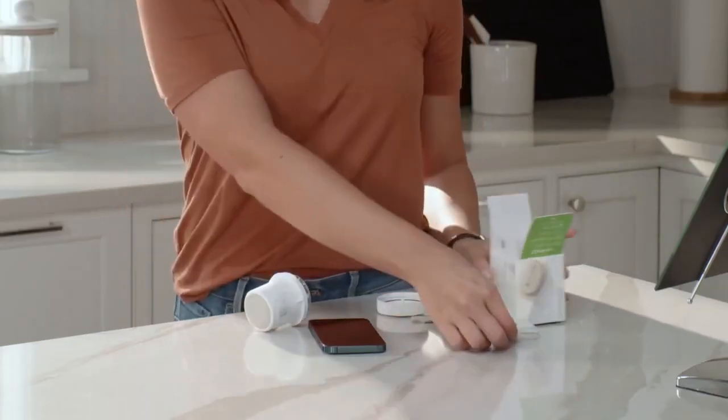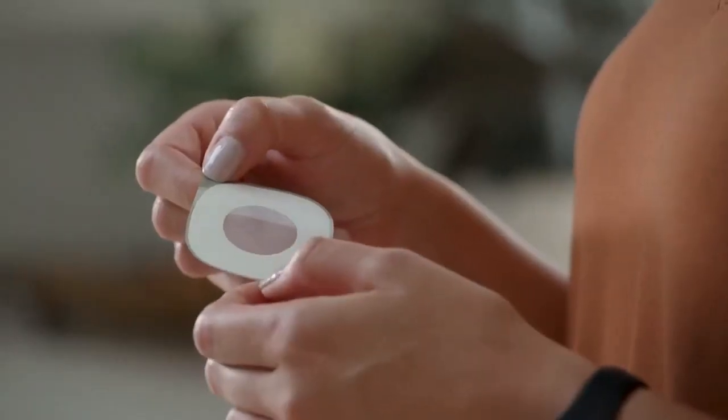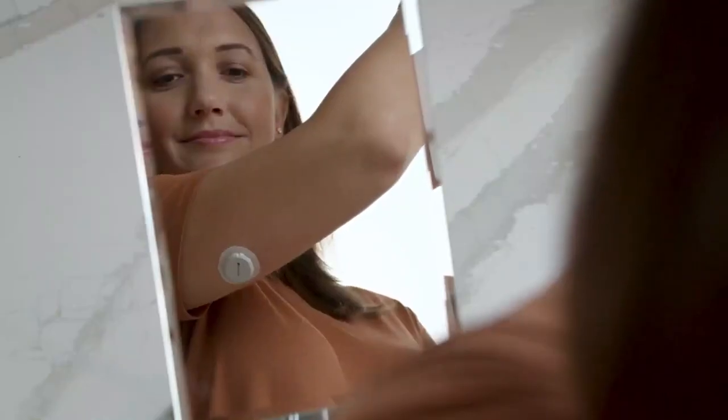Your overpatch will help you keep the sensor on and is bundled with your instructions in the box. Carefully pull off the clear liners one at a time. Please don't touch the white adhesive area. Use the colored tab to place the overpatch around the sensor.